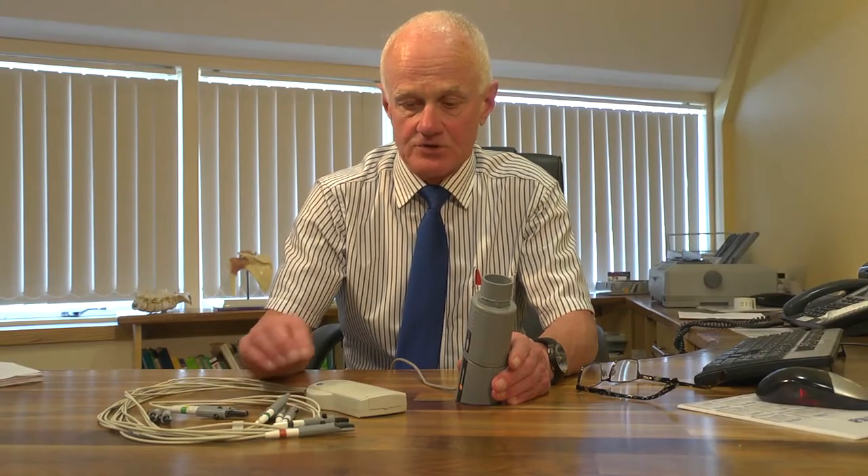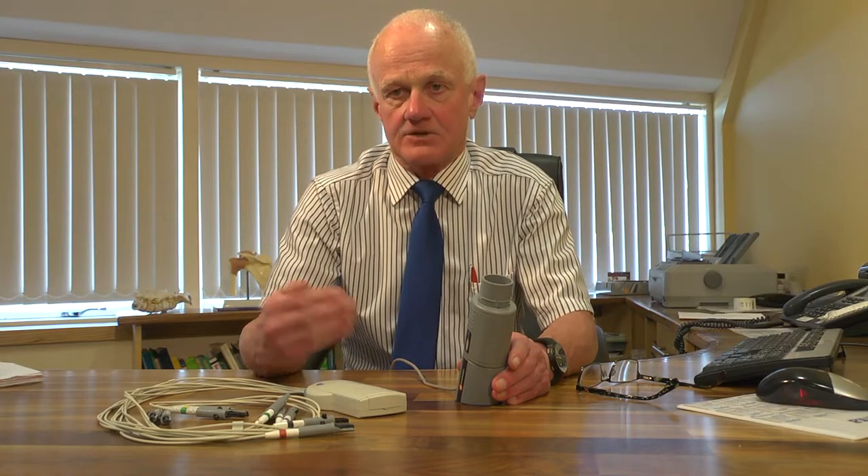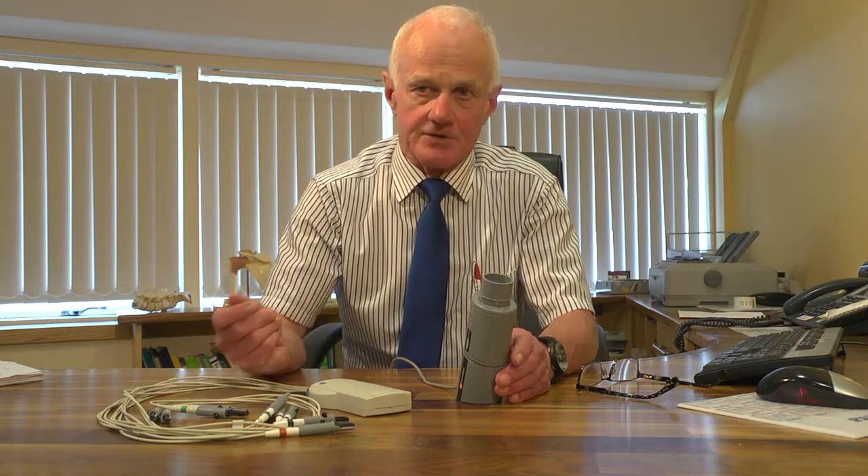Hi, my name is Dr. Rory O'Driscoll. Today I'm going to show you how to use some external devices that integrate with the patient file in HealthONE. We have a very easy integration of several external devices such as ECG, 24-hour BPs, 24-hour Holters, and Spirometers.